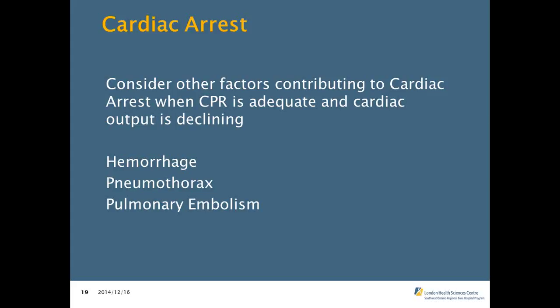And so it's important to remember that there's three things that capnography depends on. The first being ventilation. So how effectively is CO2 being delivered to the lungs themselves, or the pulmonary system? The second thing is perfusion. So how effectively is the carbon dioxide being transported through the vascular system? So how well is that heart functioning? And then of course metabolism. How effectively is CO2 being metabolized by the cells themselves?